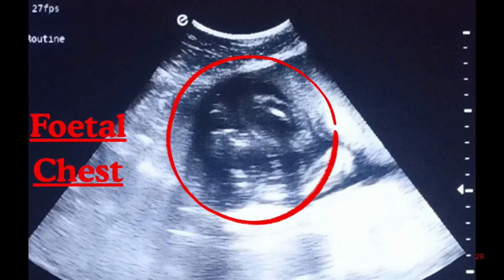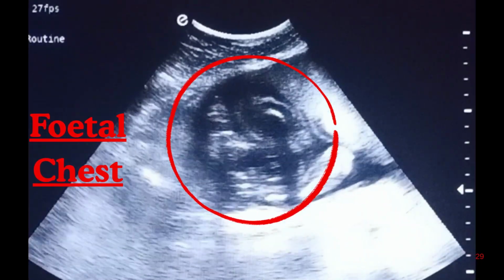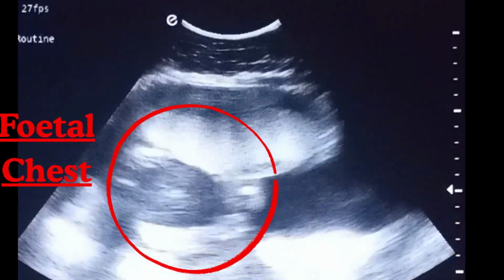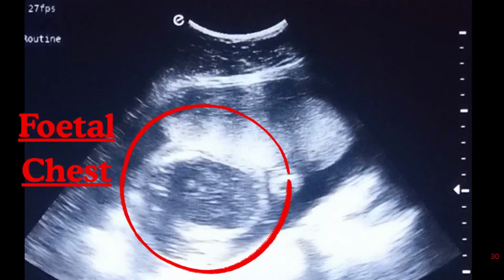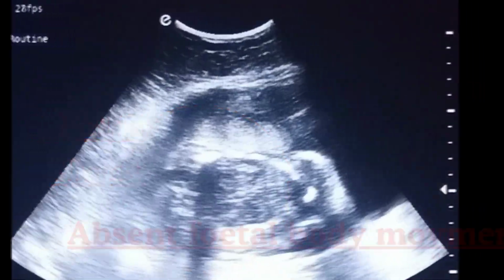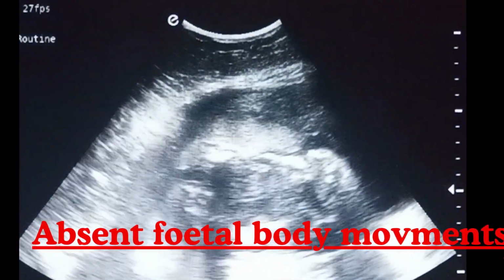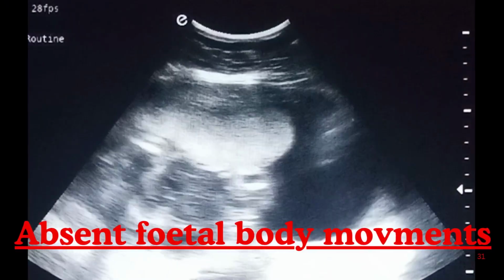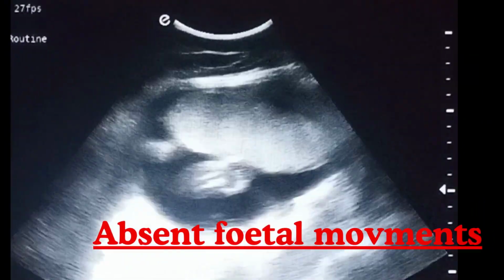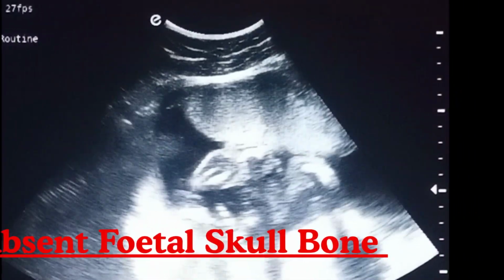Now again see the chest of the fetus, which is silent. Absent cardiac activity, absent body movements, silent chest, and absent breathing movements confirm intrauterine fetal demise.